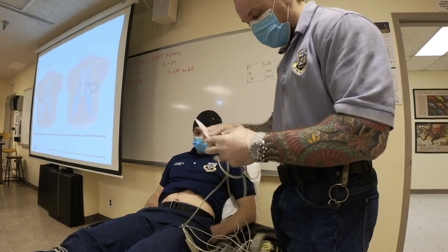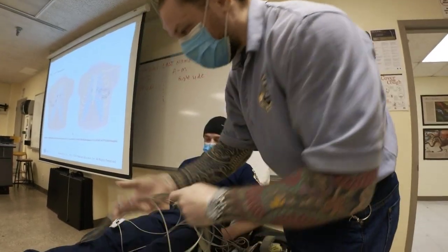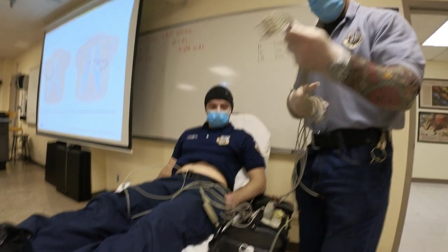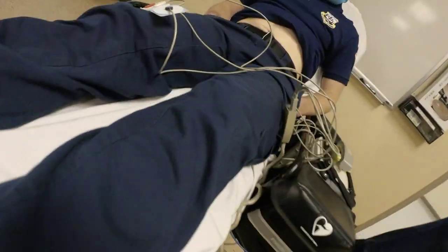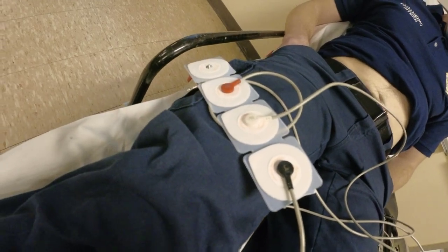So I got my limb leads connected. Next thing I do is my pectoral leads, my chest leads, right? So I have them here. Get your electrodes. By the way, do electrodes expire?